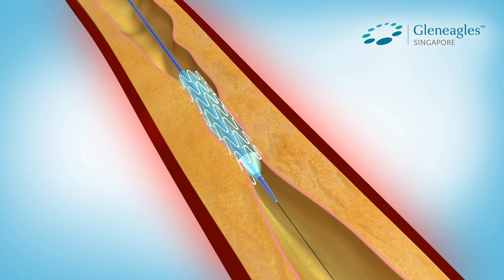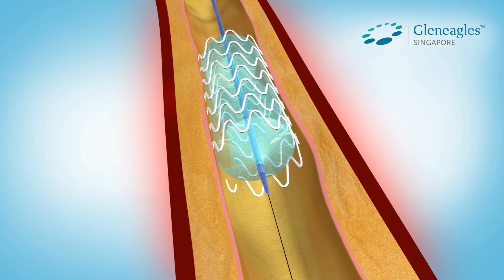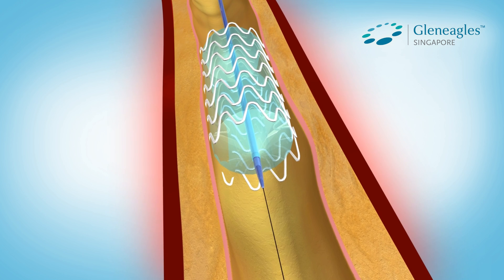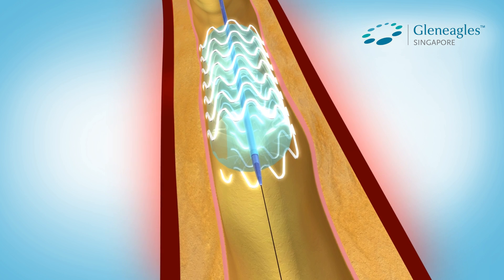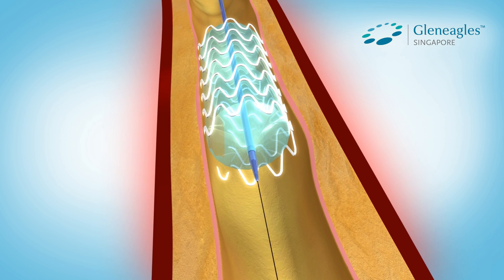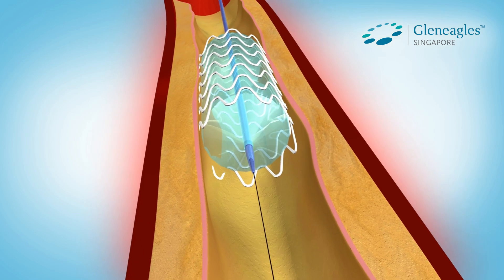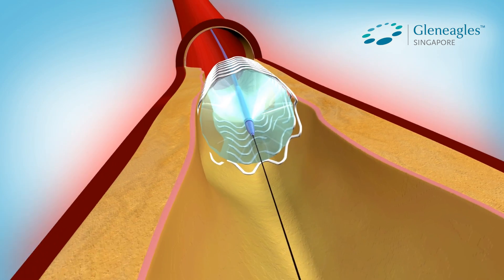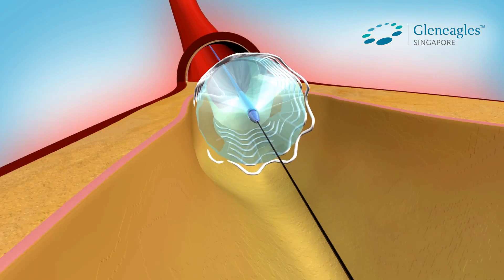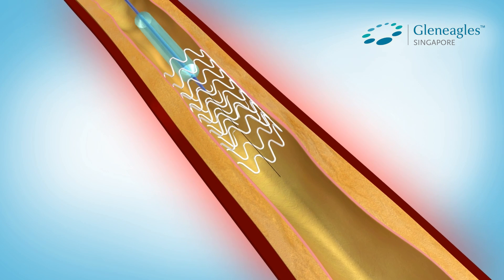Once in place, the balloon is inflated, which compresses the plaque against the artery wall and stretches the artery open to allow an increase of blood flow to the heart. In most cases, a small metal mesh tube known as a stent is expanded together with the balloon, acting as a scaffold to support the artery by expanding to its size and holding it open. The balloon is then deflated and removed while the stent is locked in place to prevent future deposits.